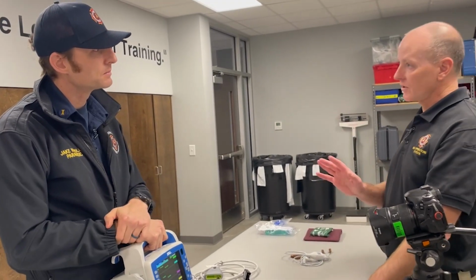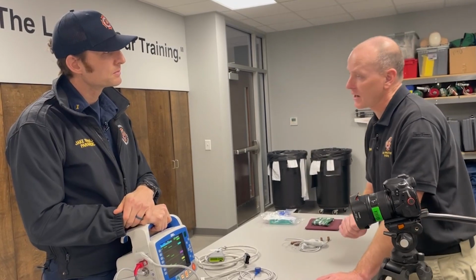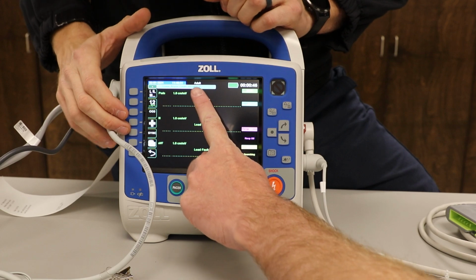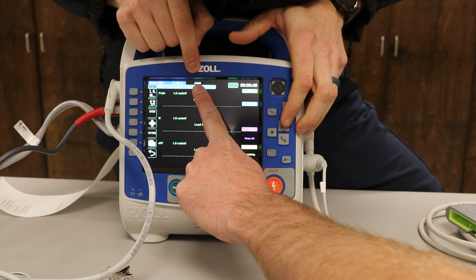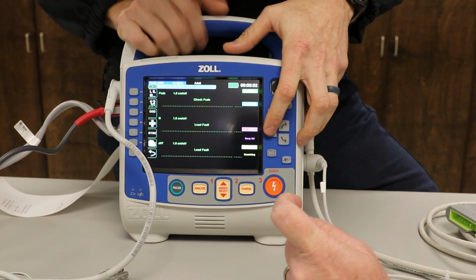Now we're doing anterior and lateral placement, the old traditional one, or what would be our vector change nowadays. We're going to show them how to put in pediatric. So if you guys notice, the first thing you're looking at here is that your Zoll monitor is showing it's in adult mode. So with that being said, it's in adult mode.